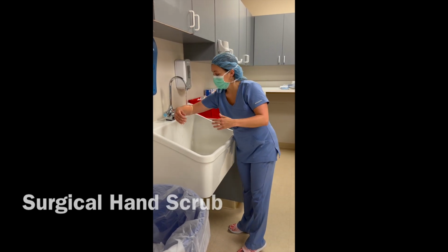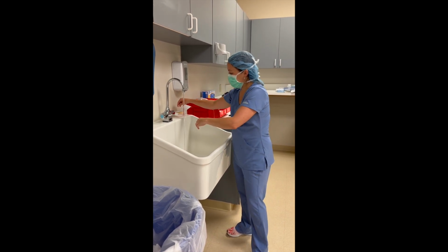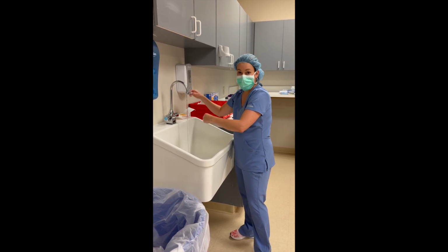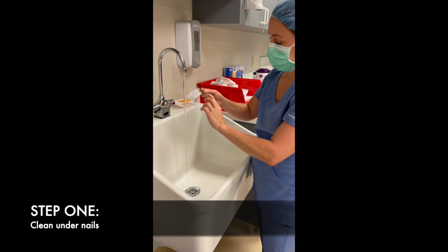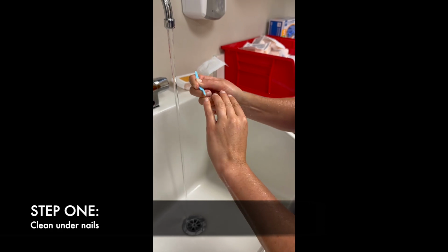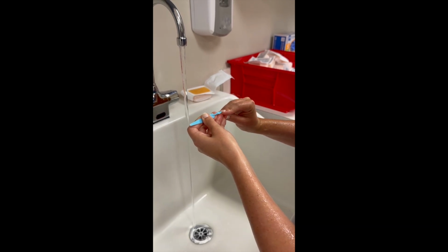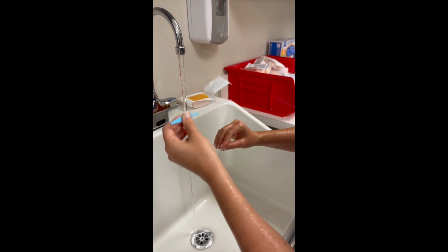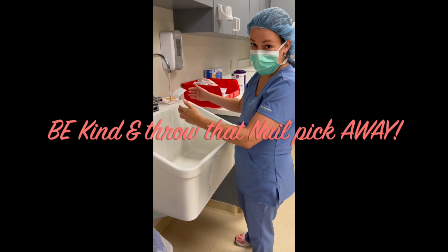I'm gonna wet my hands real quick, because I really don't want to try to fight and scrub over dry skin. Some people will take the scrub brush and the nail pick all together. That's what comes in your scrub brush pack. Some people just take the nail pick. So I'm just gonna take the nail pick to start, okay? I'm gonna get under each one of my nails, and make sure I get all that grime out. And I will rinse that away, that's just gross. I'll do it with each side. And I'm gonna throw this away. I'm not gonna throw it in the sink so it can go down and cause a big drain, okay? I'm gonna throw it away in the trash can that's usually located near the scrub sink, all right?